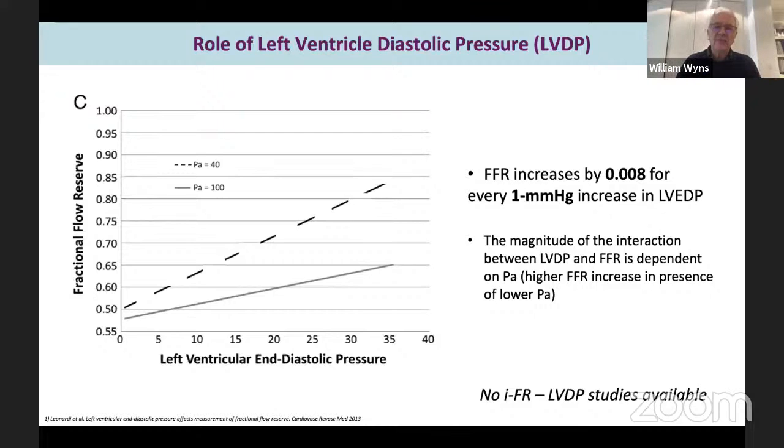Yeah, and that's a common theme with FFR, iFR. You can always find physiological differences that it's not 100% correct, but in a pragmatic way, in the range of pressures that we're working with in the patient, it doesn't really matter here. Look, FFR increases by 0.008 for 1 millimeter. So if you have a 10 millimeter increase in diastolic pressure, it will only be an FFR increase of 0.08. So really, it doesn't matter much. Maybe there are a couple of situations where it can matter, particularly if you're looking at borderline stenosis.